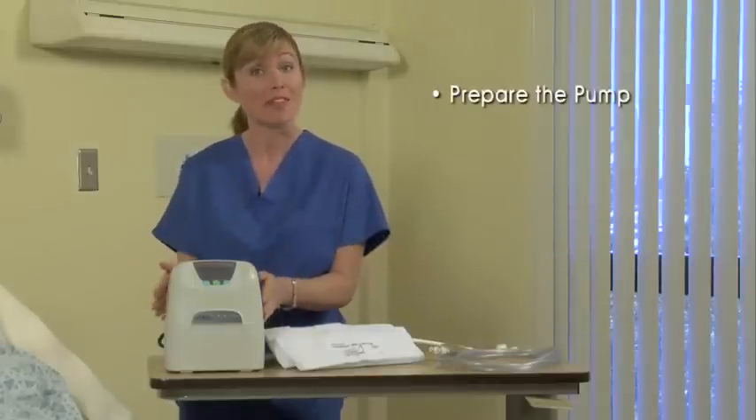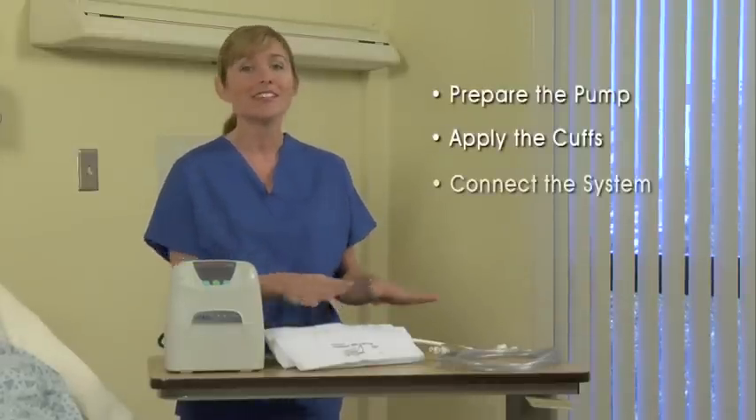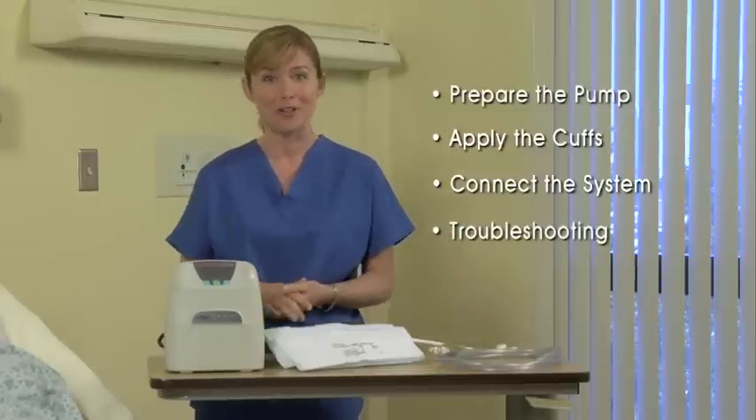Today I'm going to demonstrate how to use the Venaflow Elite device, as well as how to troubleshoot any issues that may arise. This demonstration consists of four basic steps: preparing the pump, applying the cuffs, connecting the system, and troubleshooting.